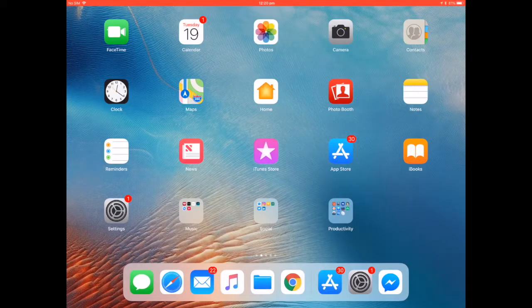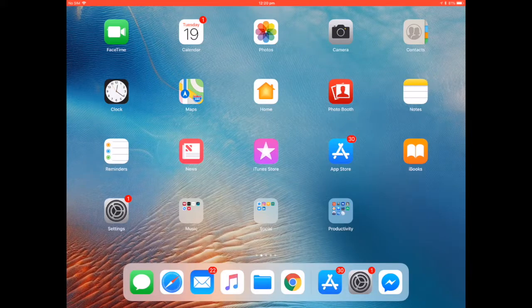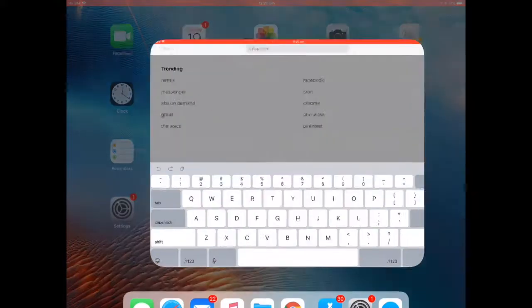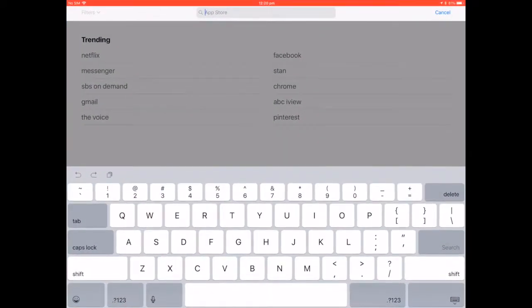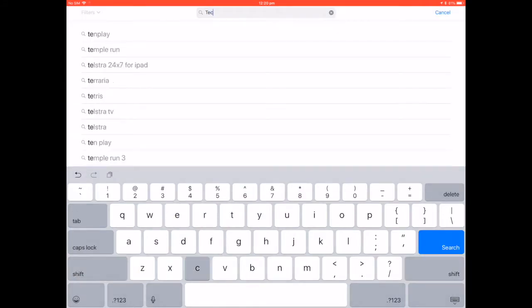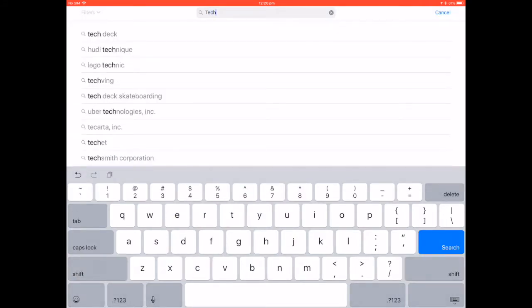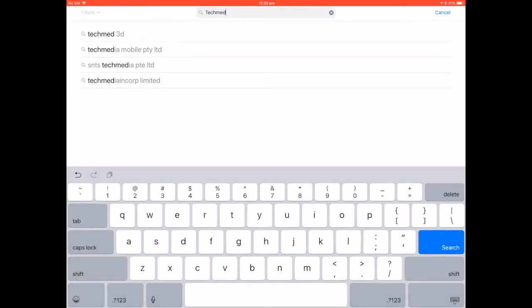Hi there, George Merrily from Footwork Podiatric Laboratory, showing you how to download the new version of the TechMed app. You need to open up the App Store and type in TechMed. Once you do this, you'll notice TechMed 3D comes up at the top of the list.